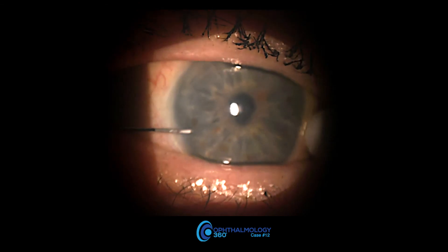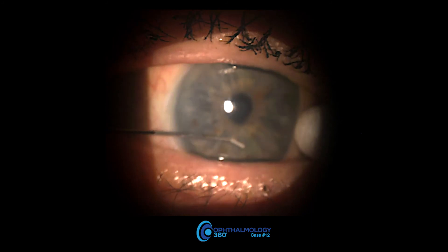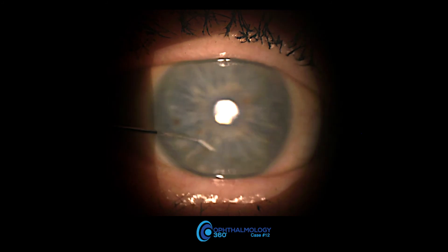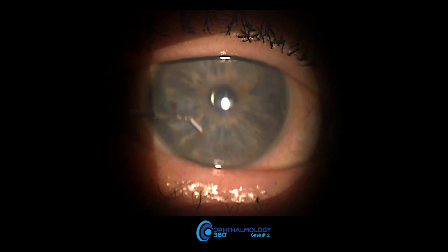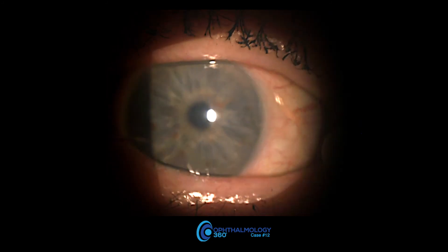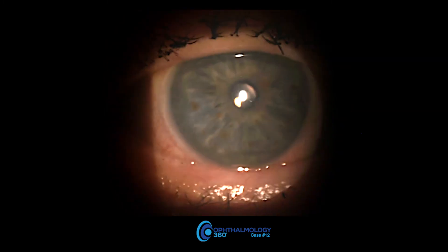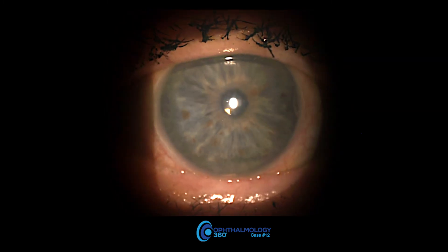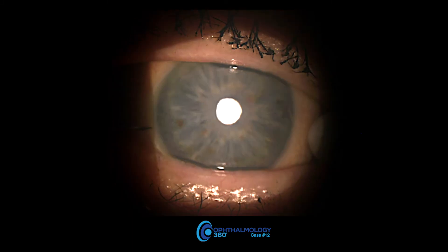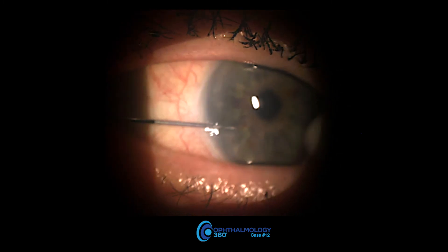This is a demonstration of injection of the Darista, or bimatoprost implant, for glaucoma. The physician will usually need someone else to help them hold the upper lid for the patient. I often and almost always do a counter pressure, sometimes with a Q-tip which I soak in a couple of drops of proparacaine, or my finger. I think if I can use a finger on someone with a lax lid, it stabilizes the eye.